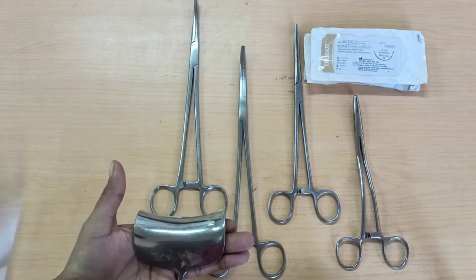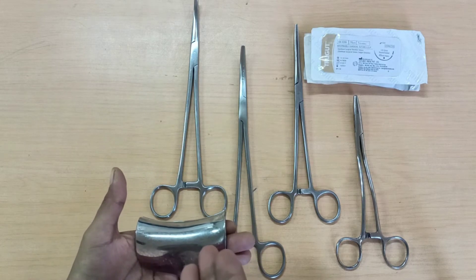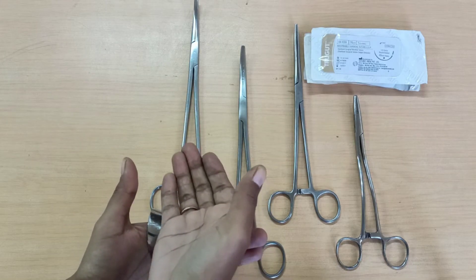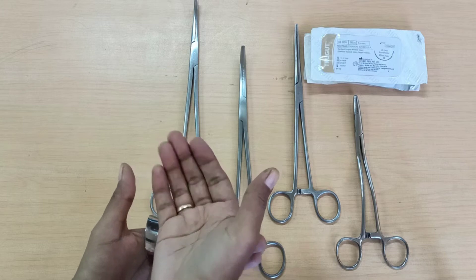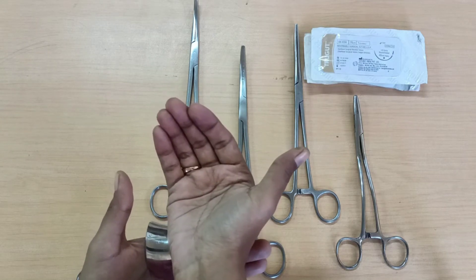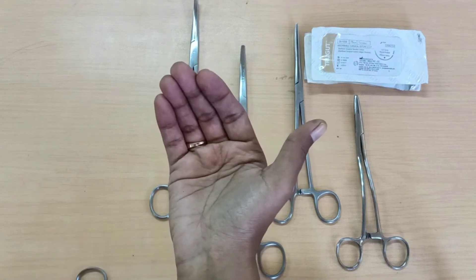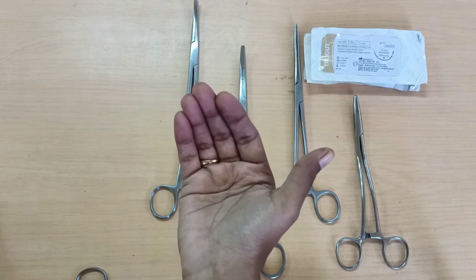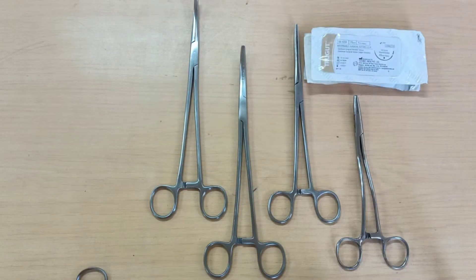Now the uterus has been incised. Next is extraction of the baby. You are going to put a hand inside the uterus and grasp the part occupying the lower pole of the uterus. When you have a good grasp, you take out the Doyne's retractor and then finally take out the baby.